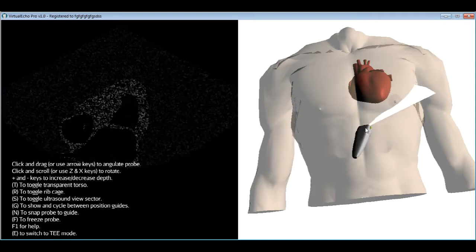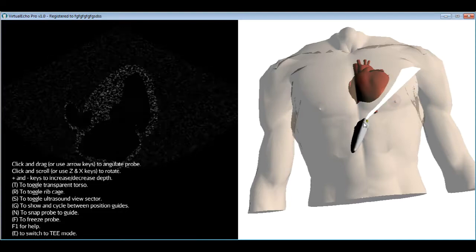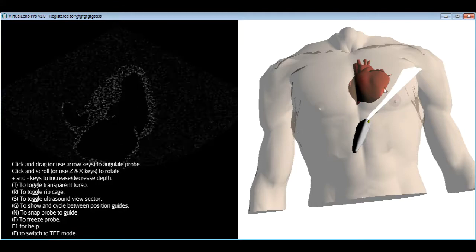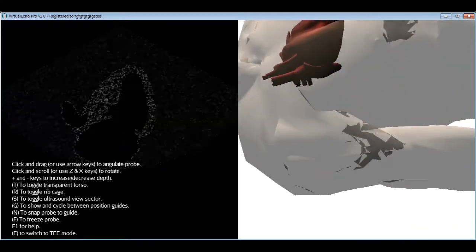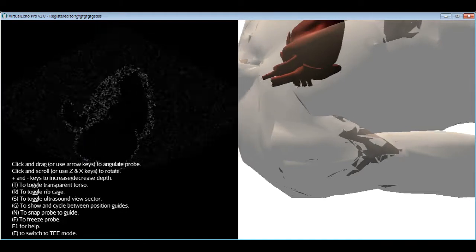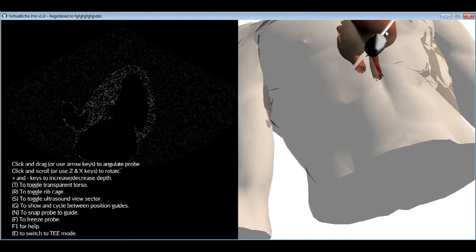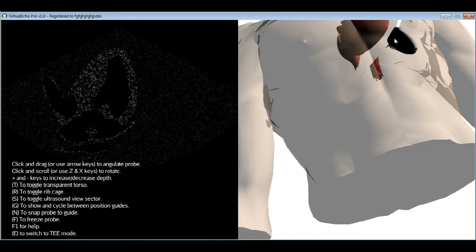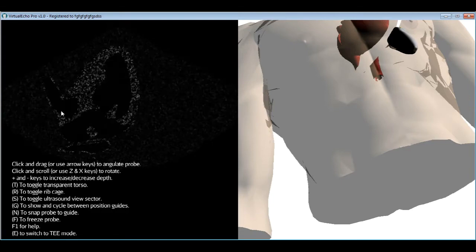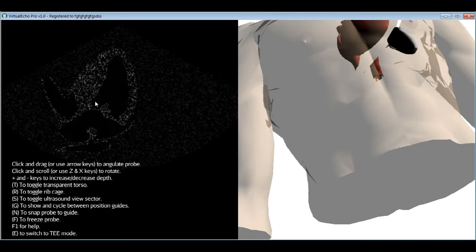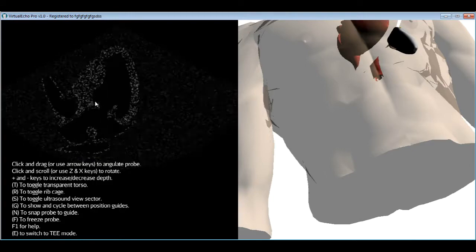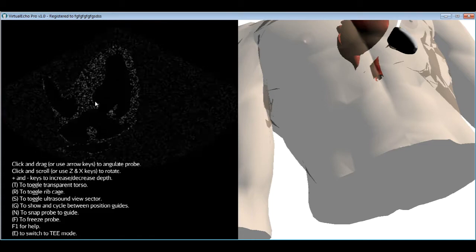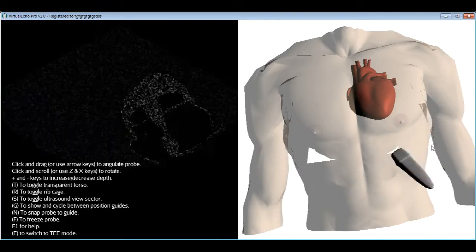The second value of the subcostal view is that rotating the probe's knob upward allows visualization of the IVC — the inferior vena cava — entering the right atrium. Measuring the IVC diameter and its relationship to respiration is used to estimate right atrial pressure, which in turn is used to calculate pulmonary artery pressure when added to the tricuspid velocity — but that is the subject of another tutorial.